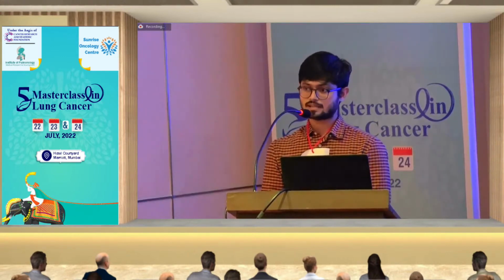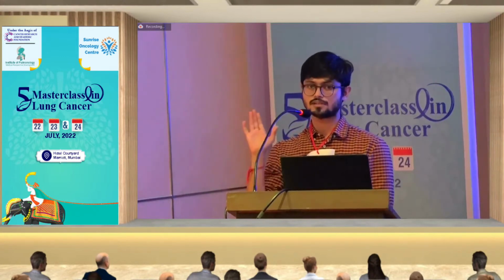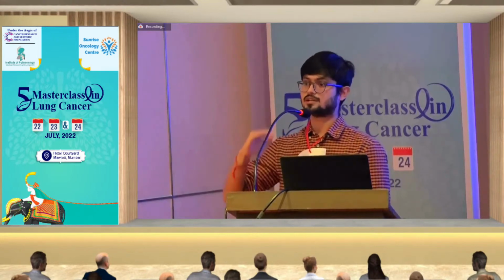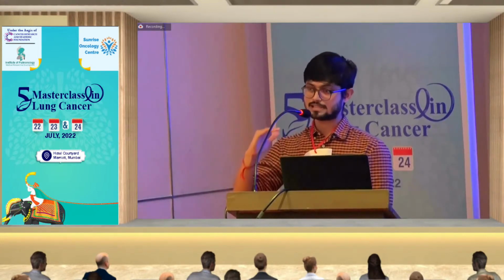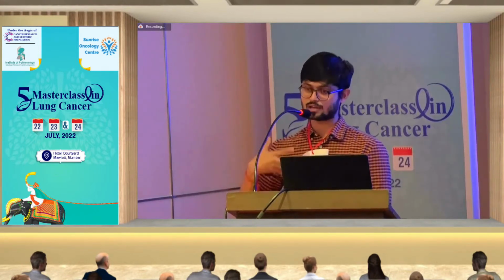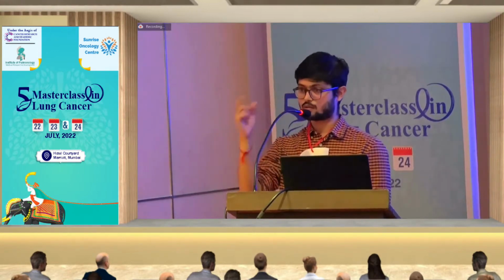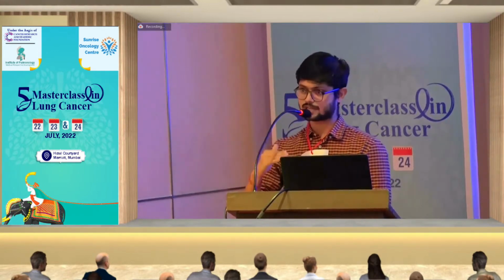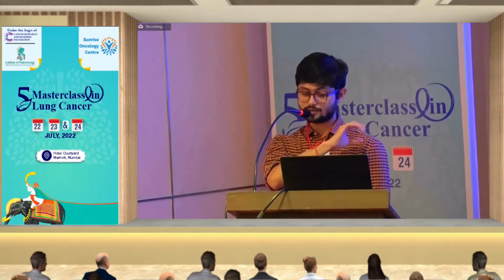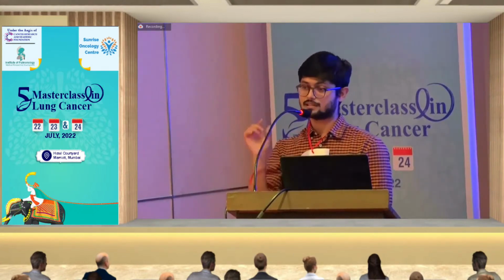So many centers do respiratory gating. With these machines, they have a software. They will take a mid-inspiration CT scan, and the PET scan for a particular bed will last longer than a CT scan, right? So they have to corroborate that PET finding. For the mediastinal and lung bed, they will take the PET scan for a longer time.